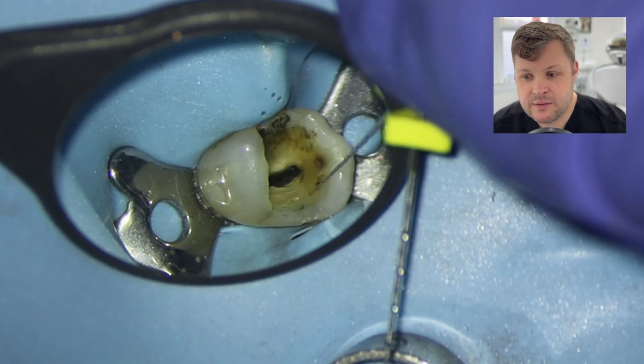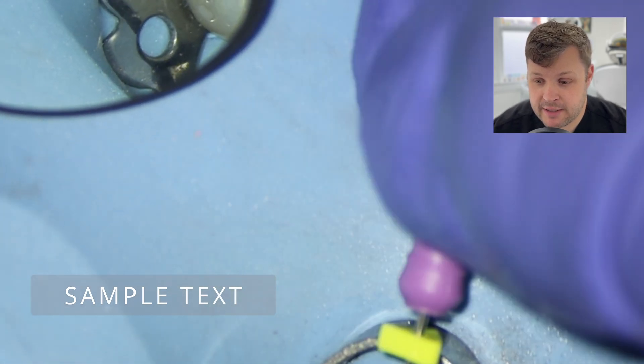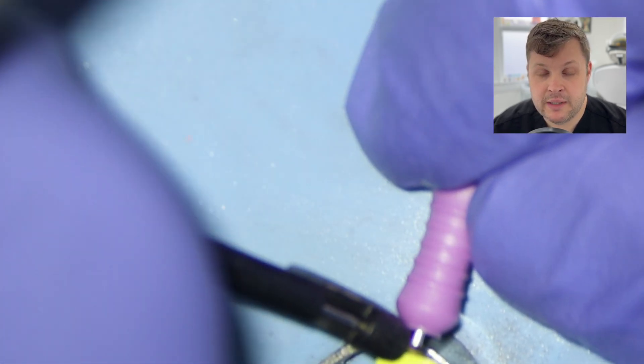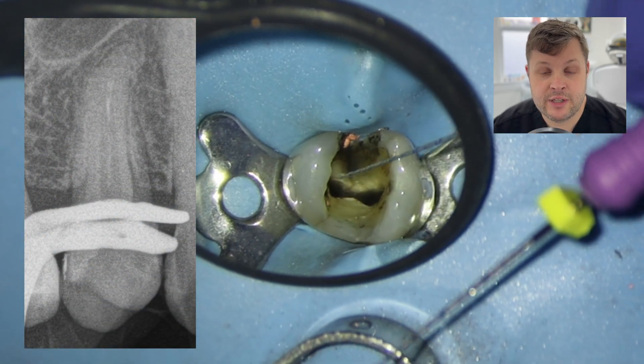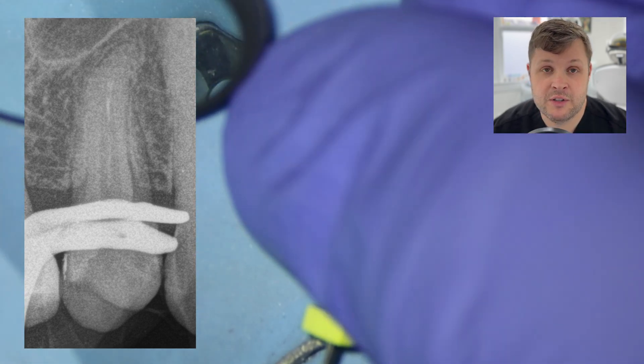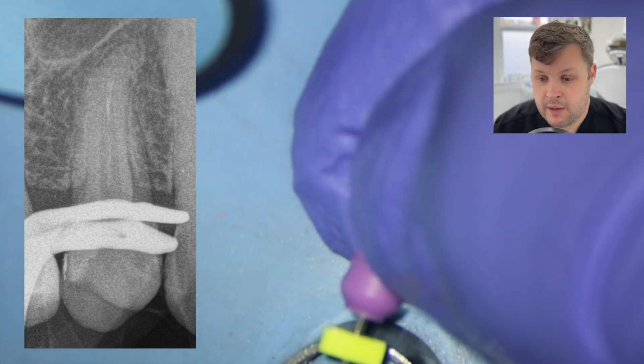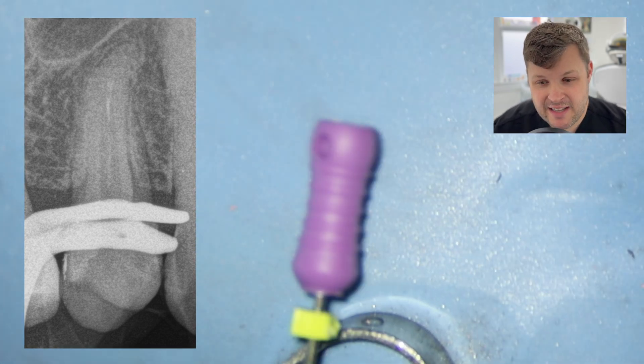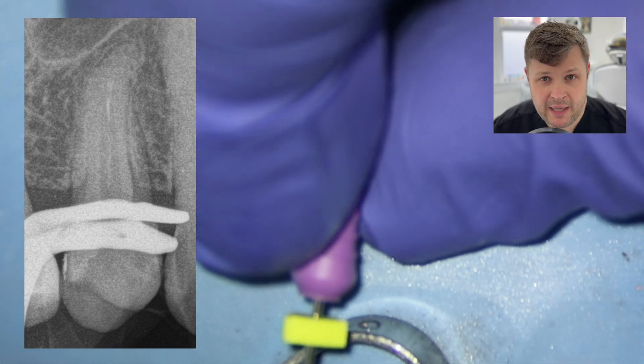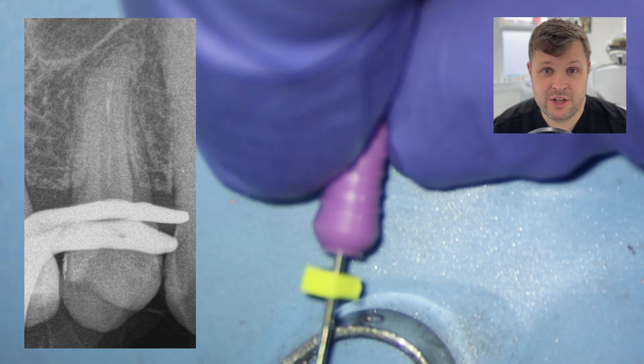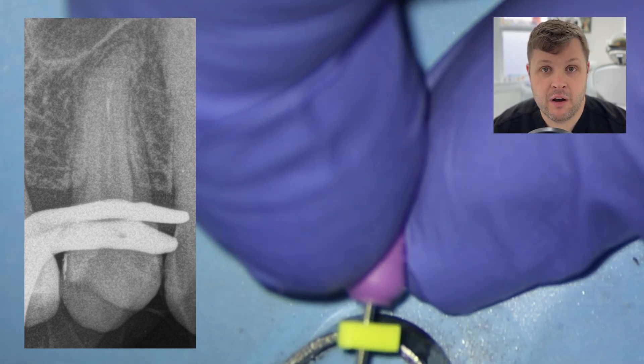Now I'm going to take a working length X-ray. I'm using a D-Finder size 10 with a very small watch-winding motion and checking the apex locator for a zero reading — I'm not getting one. My concern is whether this is due to the difficult anatomy and calcified canal, or remaining GP preventing me from reaching the apex. I take a periapical radiograph, and while there is a little GP remaining, I don't think that's the issue — it's mainly the calcified anatomy.